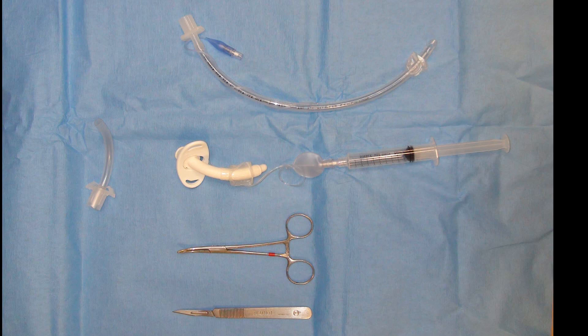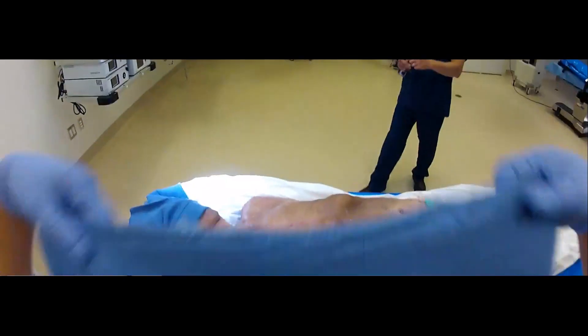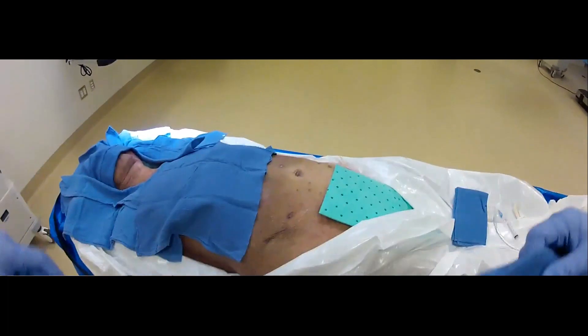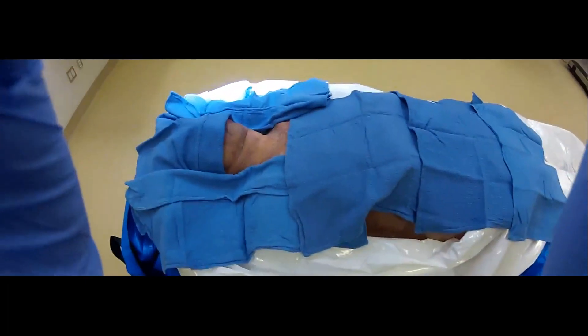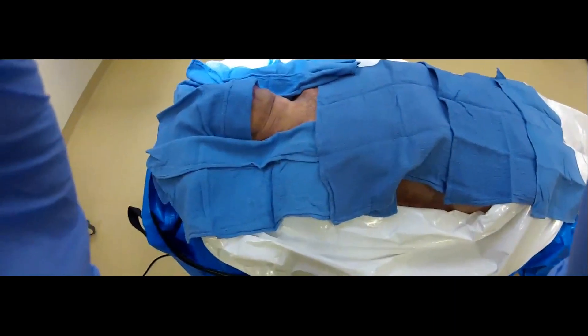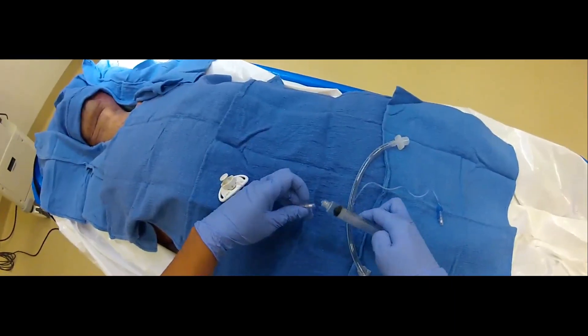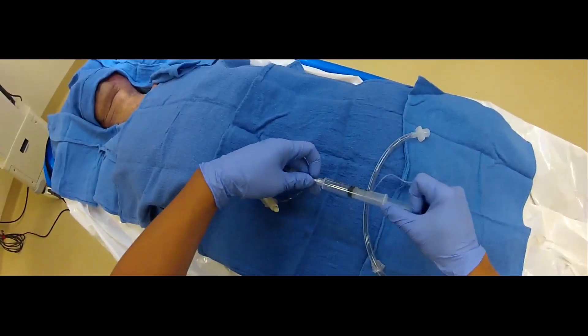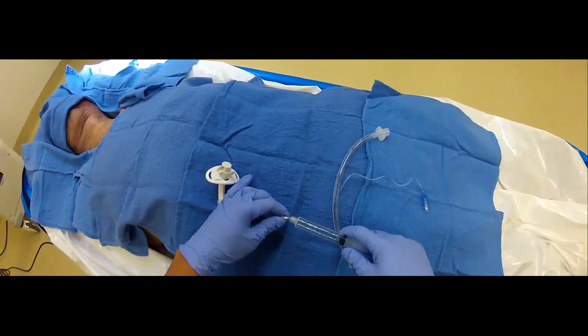In terms of patient positioning, the patient should be in a supine position with their head in a neutral position. If there are no concerns for an unstable cervical spine injury, then the patient may be placed in an extended or sniffing position. Prior to inserting the definitive airway, the cuff should be inflated to ensure that it is intact.